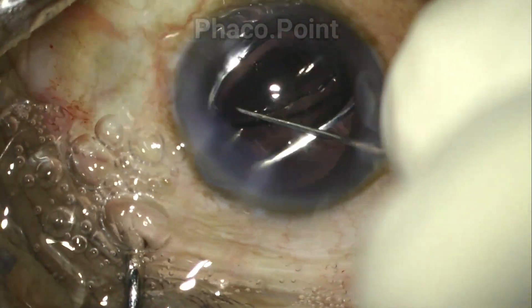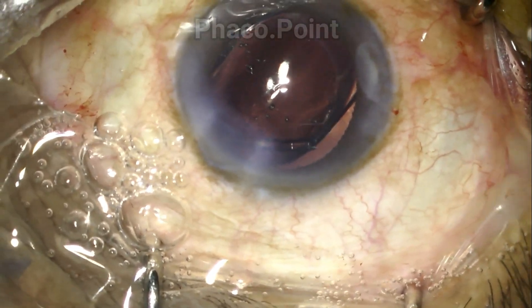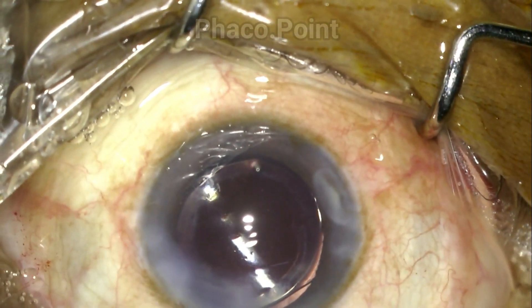Finally, the insertion of the IOL proceeds, and as you can see, the IOL is injected with significant ease. It is completely folded; the haptic now opens out, and at the end of the surgery you have a well-centered IOL in the capsular bag.